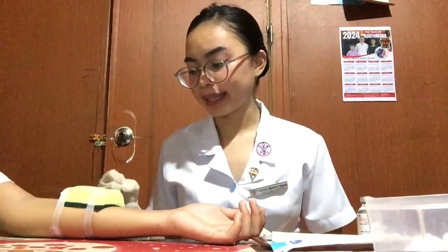And we are going to shade the site with a black ball pen. So good day everyone, and now I'm going to perform the subcutaneous injection.